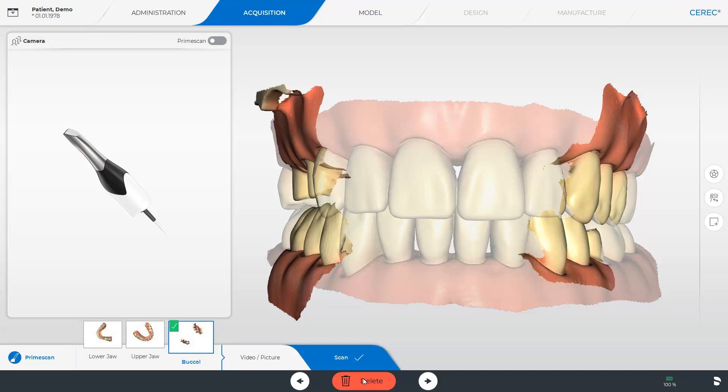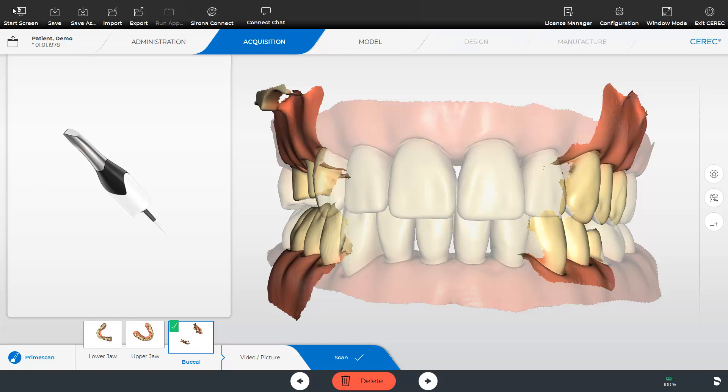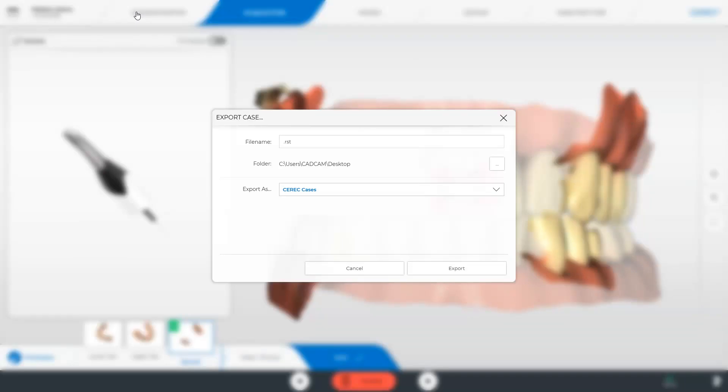At this point you have the first opportunity to export the scan data. Therefore we open the system menu after all the scans have been performed. In the acquisition phase you can access the export function. A new window opens. Here you can define the file name and determine the folder to which you want to export the scan data.